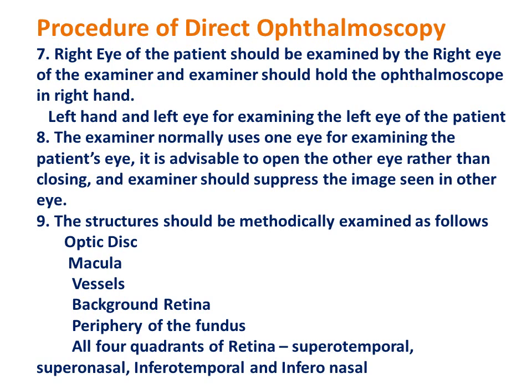directions conveniently so that you can see the superior aspect, inferior aspect, medial aspect and the lateral aspect of the retina. All four quadrants of the retina, that is superotemporal, superonasal, inferotemporal and inferonasal part should be examined with proper care so as to write the details of all these four quadrants. If there are any abnormalities, you should be able to identify and then write down in these four quadrants.